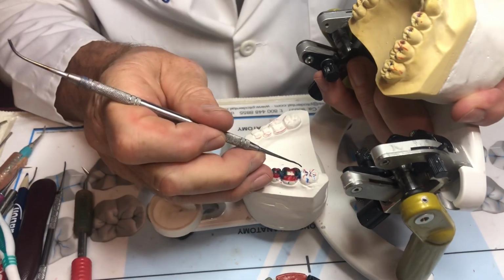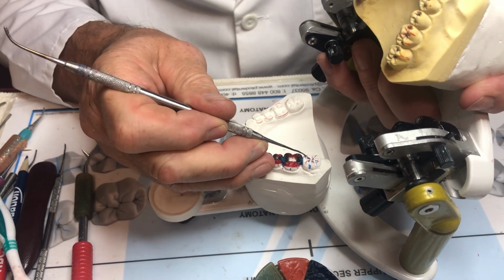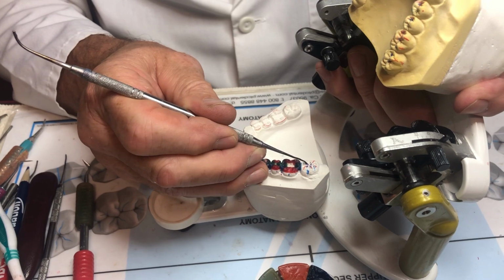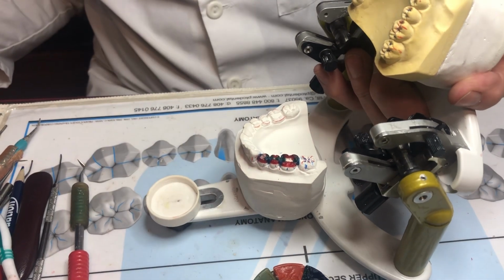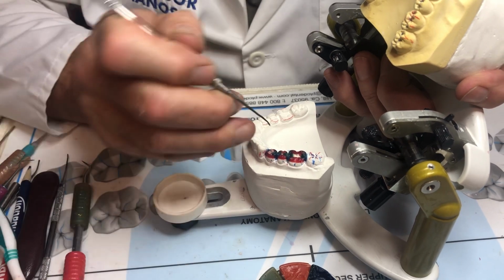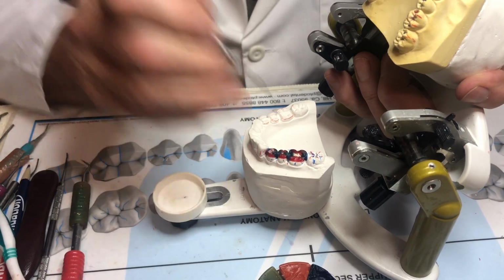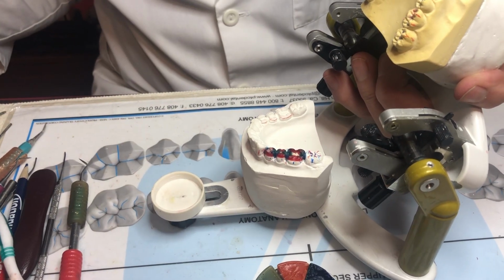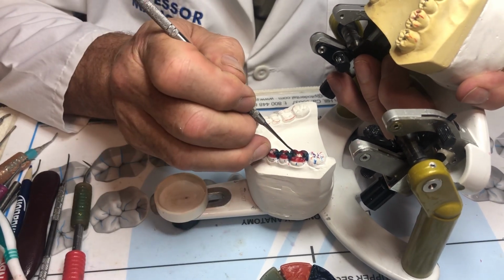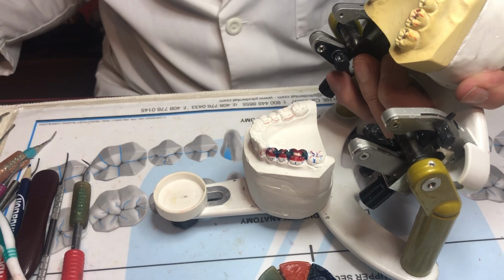Let's try, for no reason, let's just pick one. Let's pick the mesiolingual. And if you notice, it comes in a curved direction. You're probably going to have a little trouble doing this. You've never done it before. Start down in the center. Seeing that the contact is down there somewhere, I always like to establish the contact first.